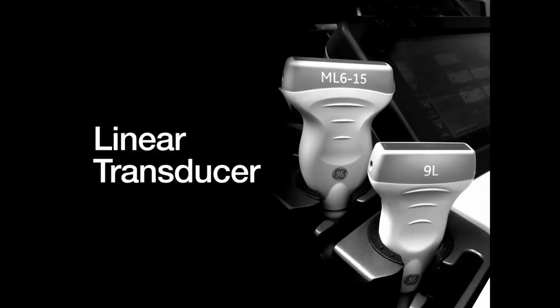I suppose if you have a hockey stick, that could work as well. I've never tried it. It might be something worth trying because you can get that narrow footprint, high resolution, but something that's going to give you that view, right? Because the nice thing about the eye, compared to all of those structures that we look at, save maybe skin and soft tissue, is that the thing is right up front, right? It's there, visible to us.